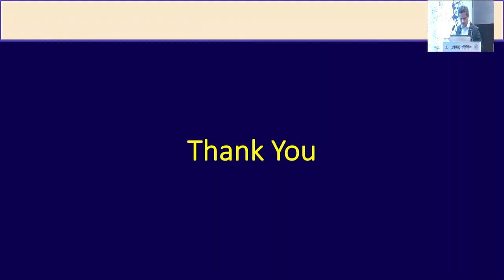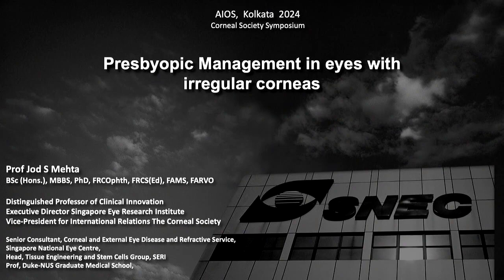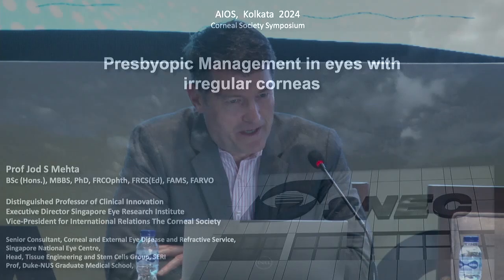Very nice presentation. I want to give you a hypothetical patient and see how you'd manage this patient. Let's say somebody who's 60 years old, central corneal pachymetry 600, no epithelial edema, no stromal edema visible on exam, but on Pentacam imaging has displacement at the thinnest point, has loss of parallel isopachs, and has posterior displacement of the posterior corneal profile. And is not happy with their vision. Do you do cataract surgery alone, or do you do cataract surgery with DMEK in that patient? Or what other factors like cell count, posterior corneal fibrosis, what other things go into that decision-making process?